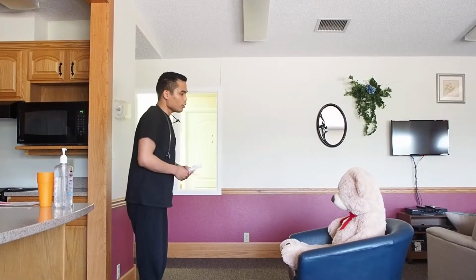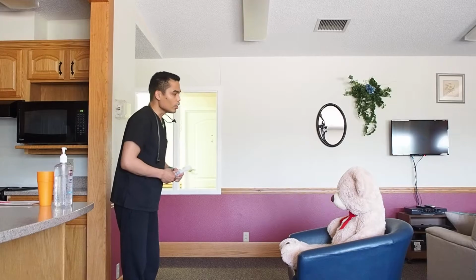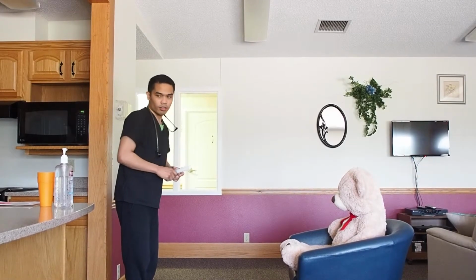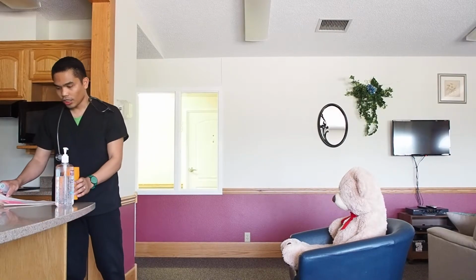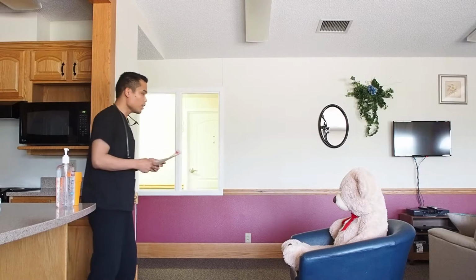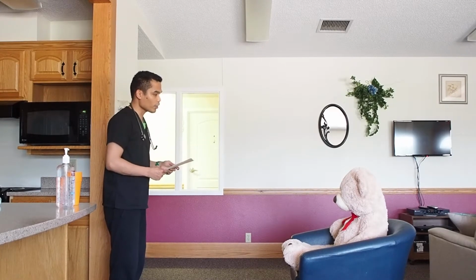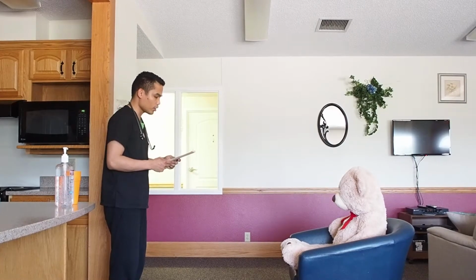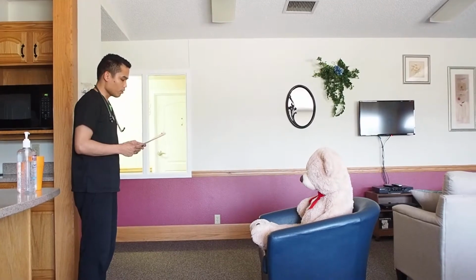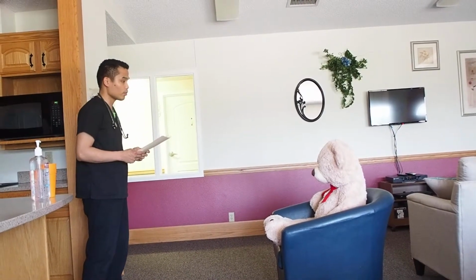So can you breathe deeply again and cough for me? Okay, thank you. So I'll just have to let you rest again for about a minute. And then another thing to note is that I just have to inform you that the medication I administered to you first is having side effects like tremors or nervousness, which is very normal. And then the other one is the Spiriva, which has side effects of dry mouth.